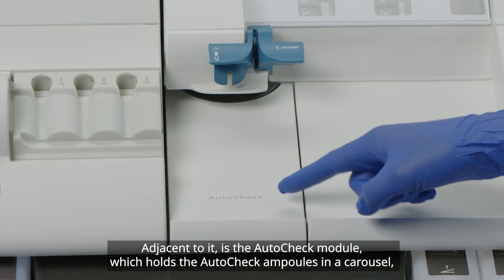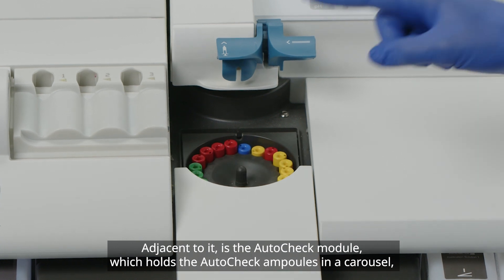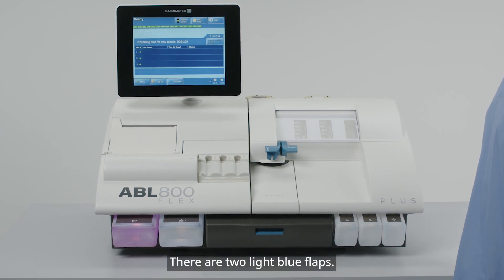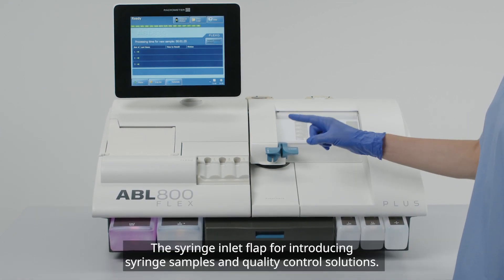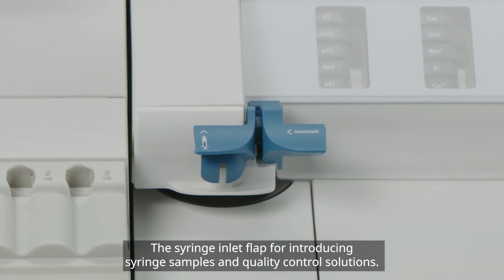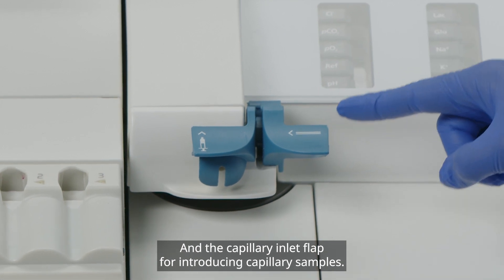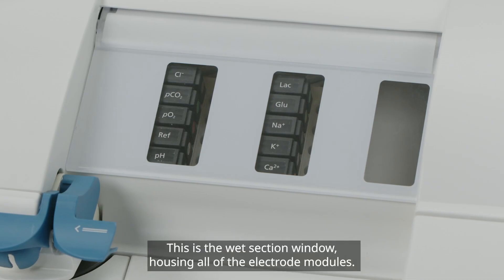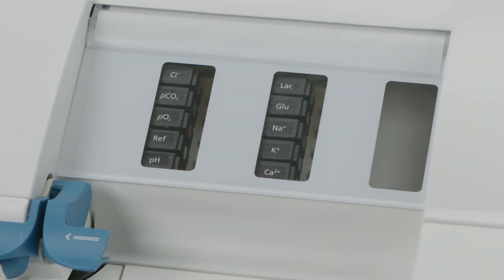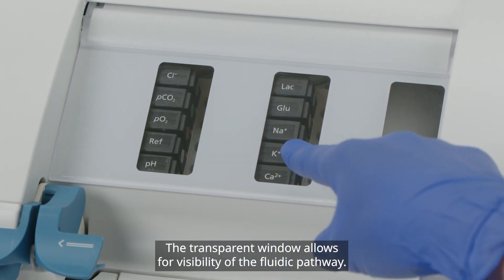Adjacent to it is the auto-check module, which holds the auto-check ampoules in a carousel, covered by a retractable cover. There are two light blue flaps: the syringe inlet flap for introducing syringe samples and quality control solutions, and the capillary inlet flap for introducing capillary samples. This is the wet section window, housing all of the electrode modules. The transparent window allows for visibility of the fluidic pathway.